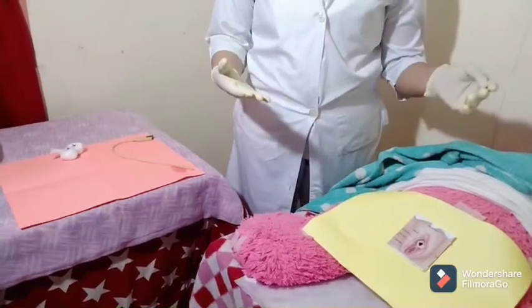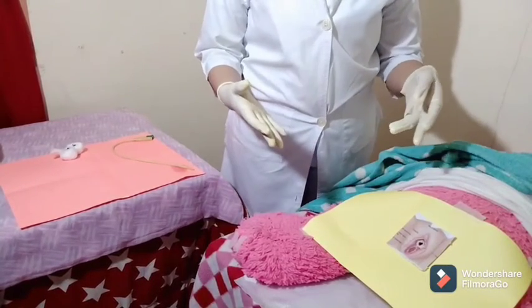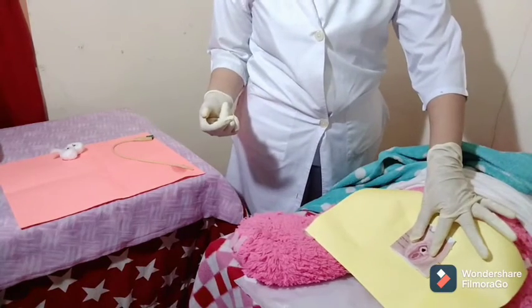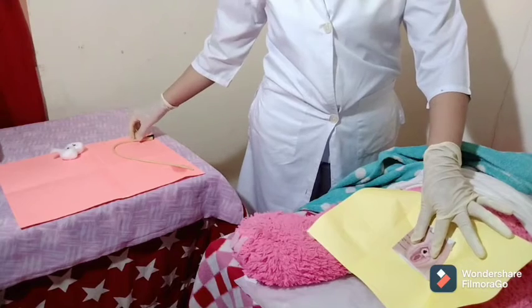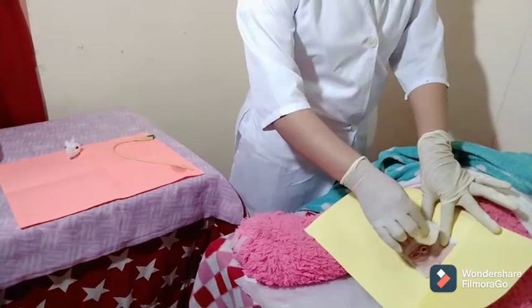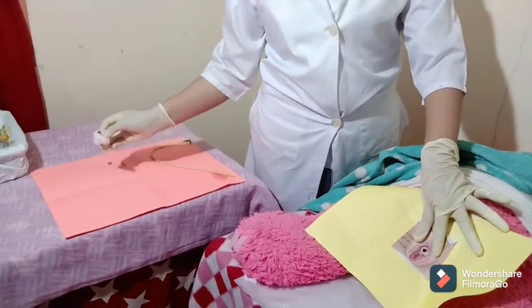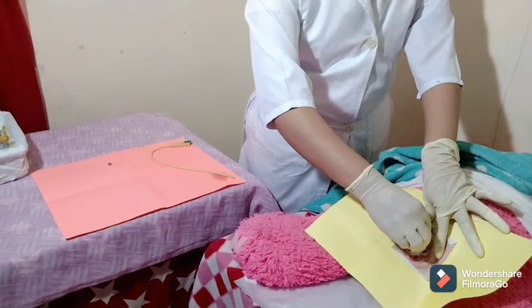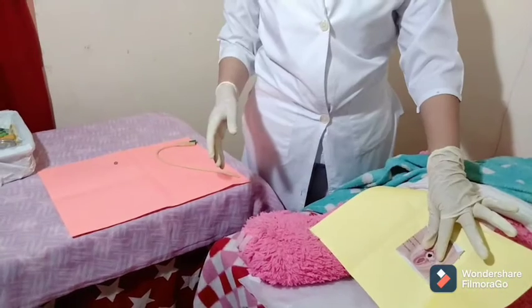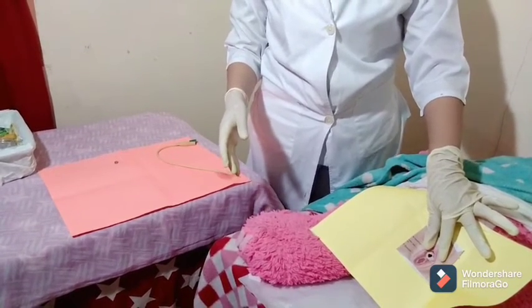With the thumb and forefinger of your non-dominant hand, spread the labia and identify the urinary meatus. Maintain this and hold until the catheter has been inserted. Cleanse starting away from you, and then near from you. Discard the used cotton balls. This cleans the area and minimizes the risk of urinary tract infection by removing surface pathogens.